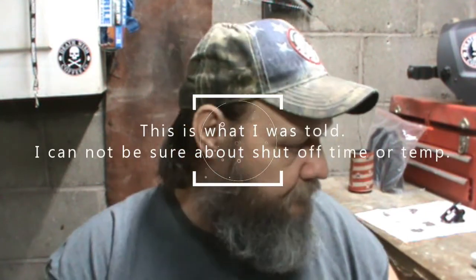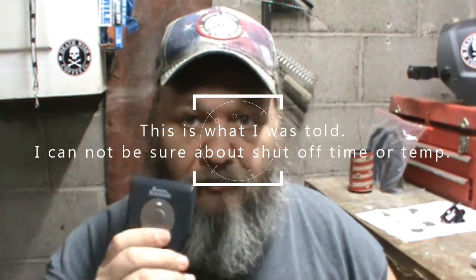The good thing about the newer units versus the older ones is I talked to Boston Scientific about it, and they're like, hey, you can lay in bed now, use these if you want to, or in your chair. They'll shut off if they get too hot. Now, I also got a time limit on them too. They'll shut off as well. But when you get your stimulator, a good rep will see a person if you're small, skinny, medium, average, whatever you are, or a person of my size.